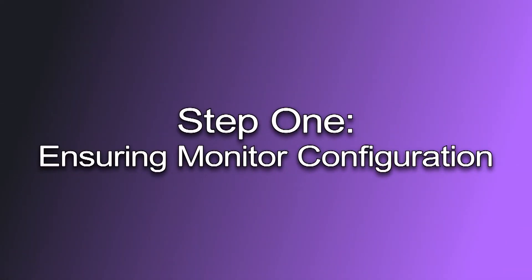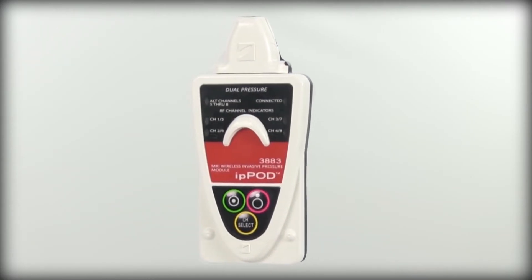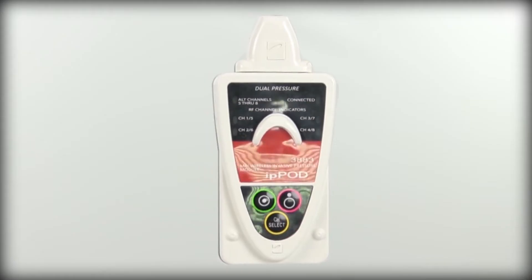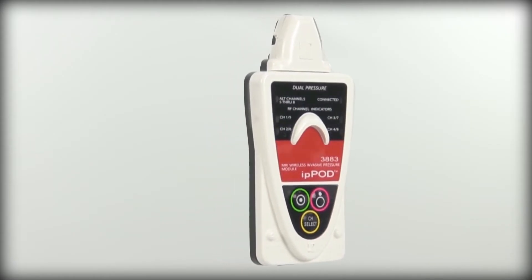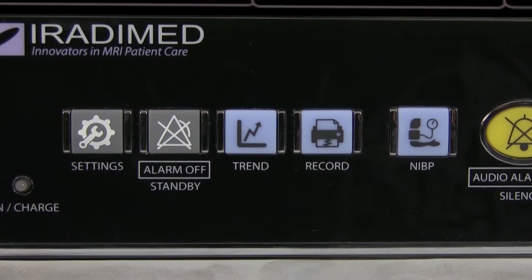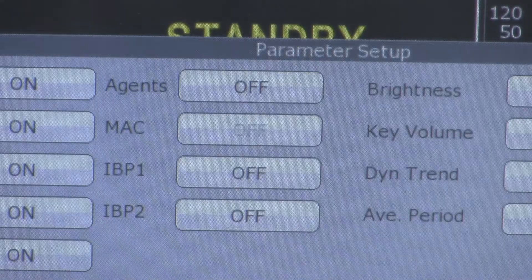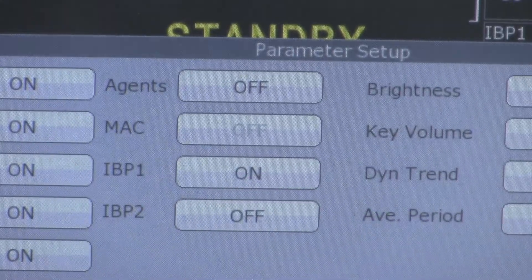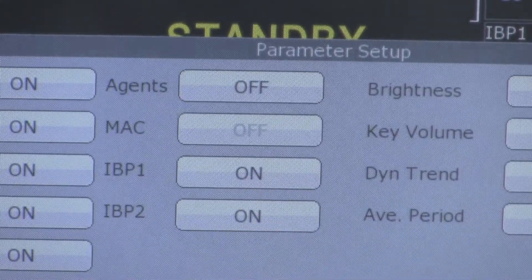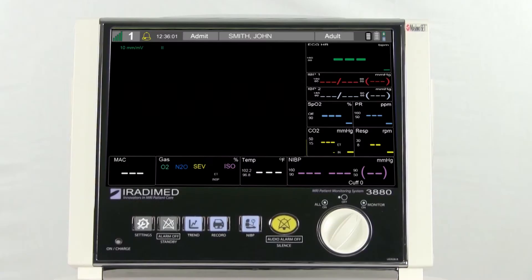Step 1: Ensuring Monitor Configuration. Before the invasive blood pressure pod can be used correctly, the invasive blood pressure section needs to be activated under the parameter setup function located under the settings menu. First, the user will push the settings button located on the front of the monitor. The user will push the parameter setup button and will then press IBP 1 and/or IBP 2. Once the user has selected IBP 1 or 2, press the back button twice. The monitor is now ready to measure blood pressure invasively.